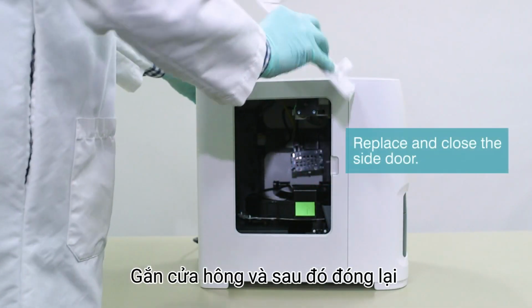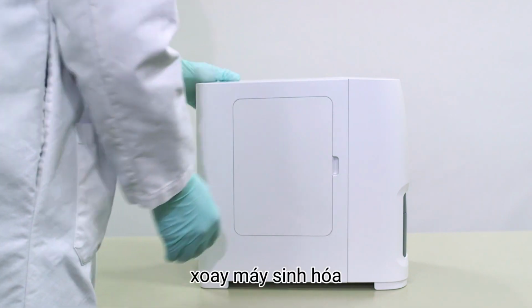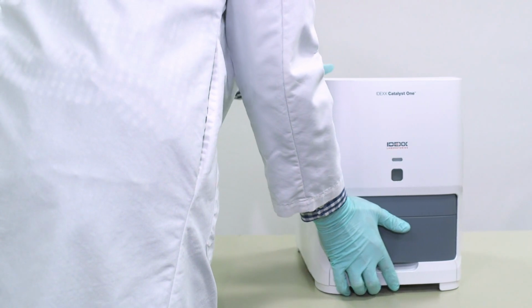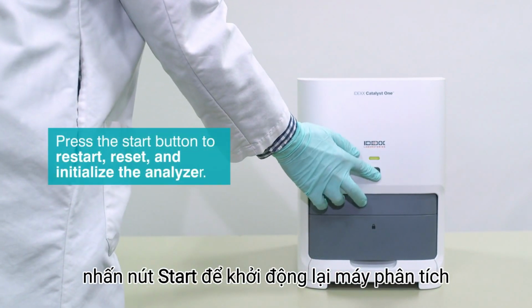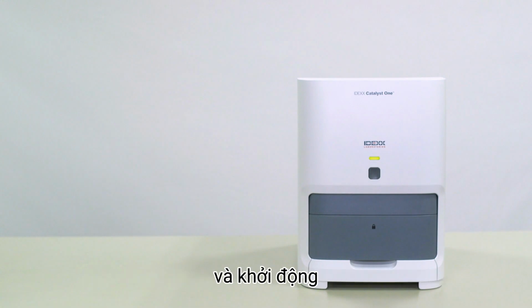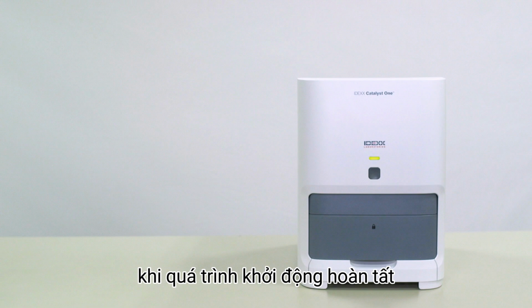Replace and then close the side door. Rotate the analyzer so the sample drawer is facing forward. Press the Start button to restart the analyzer. The analyzer will automatically begin to reset and initialize. The analyzer should return to a ready state once the initialization is complete.